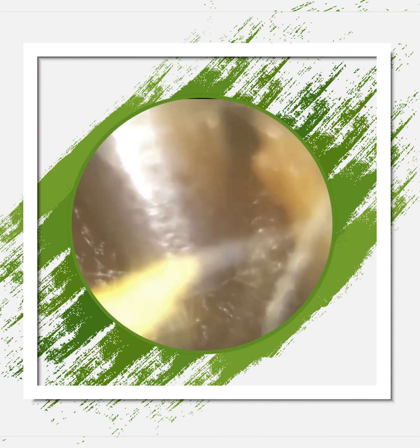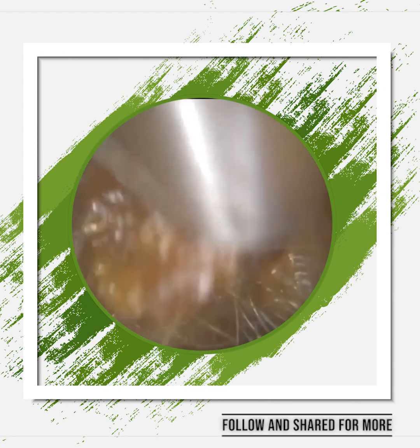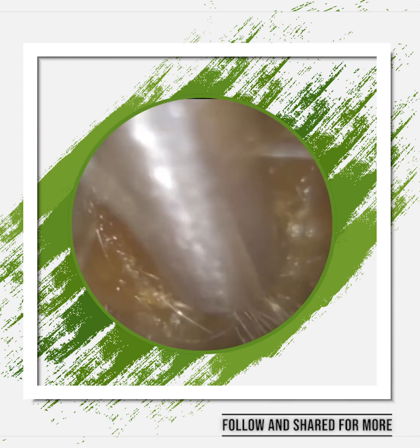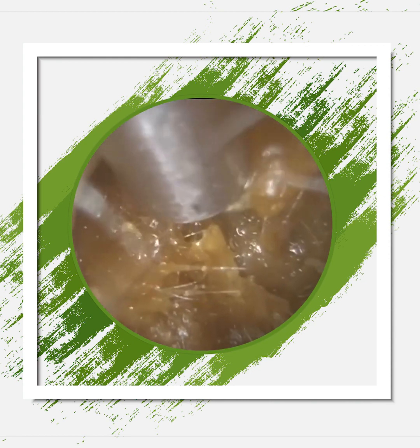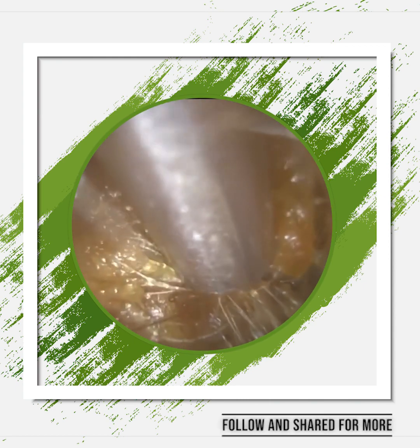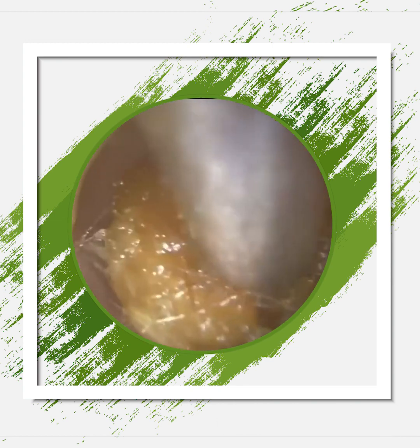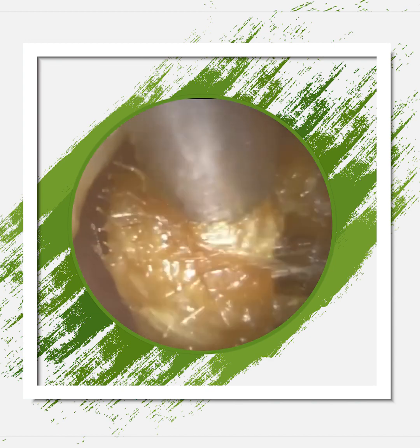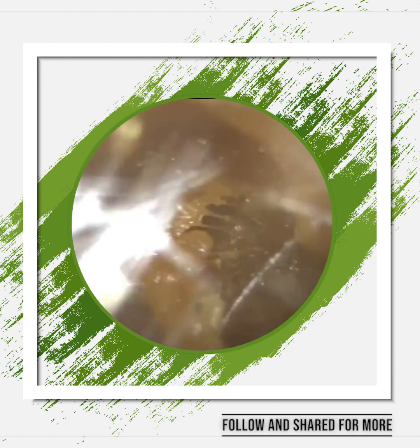I'll try to explain it so it gives you a bit of a better perspective. I'm holding the iClearscope, our wireless endoscope, in my non-dominant hand, which is my left hand, and I'm holding the sucker, the Zollner suction probe, in my dominant right hand. And with my right hand, sorry, what I did, I just retracted, so I stretched the patient's ear. I did that in the case of the right ear by pulling the ear back and up, and that widens and straightens the ear.